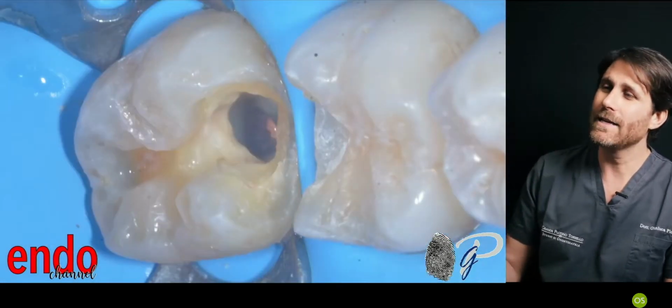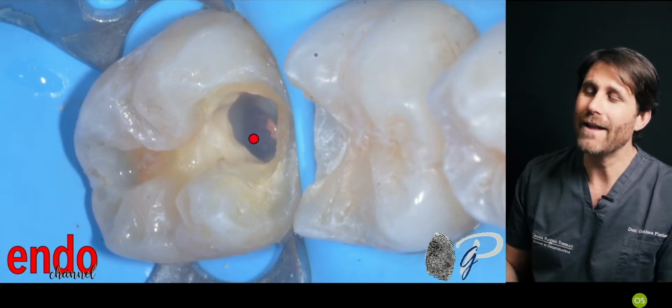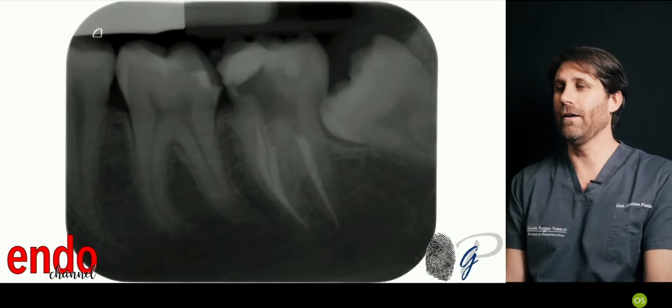and the restoration phase, in which we have to take care, obviously, to clean and to fill these undercuts of this area. This is the radiograph.